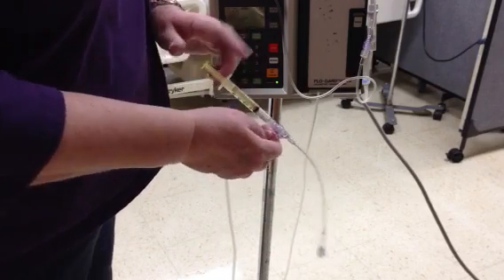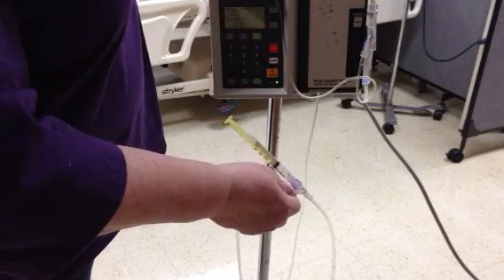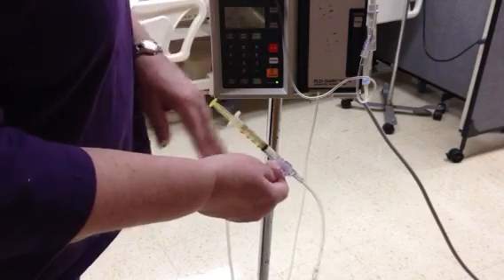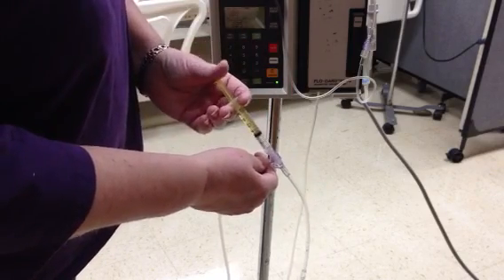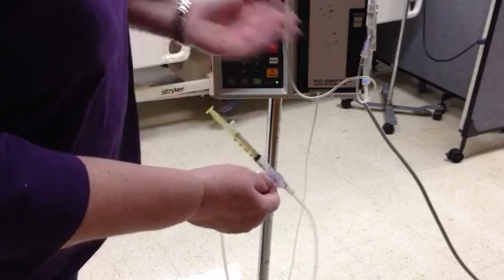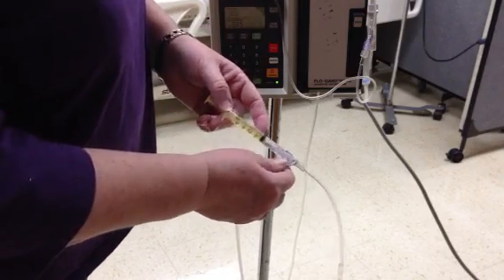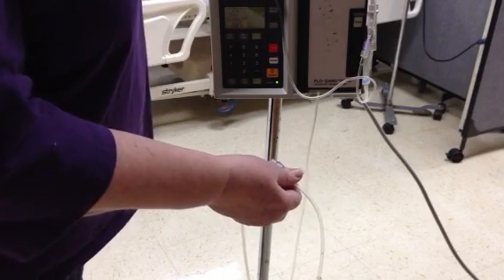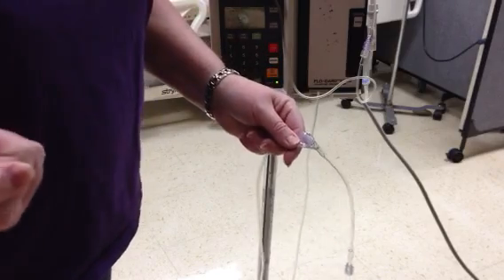Now, this is in the case that I have determined that the medication is compatible with my primary line. Then, if it's compatible, I only have to walk up here, cleanse my port, access it, and push one line the allotted amount of seconds. Push one line. Now, in the case that it is not compatible with my primary, then I'll have to treat it just like I did with the saline lock.